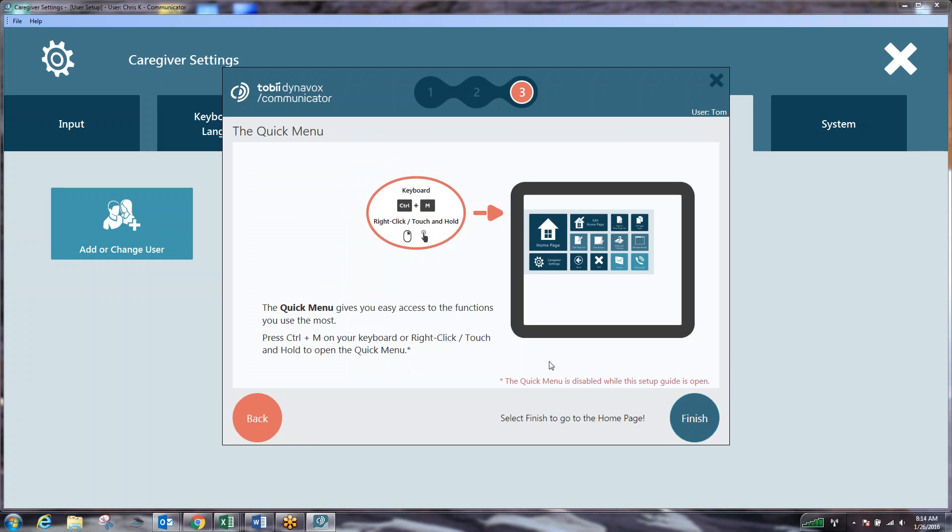What this describes now is the quick menu option. This is new to Communicator 5. If you hit the button on the left hand side of the device with three dots, you can quickly get to this quick menu guide at any time within the Communicator 5 software. Or if you touch and hold the screen it will pop up the menu. Or if you have a keyboard or a mouse plugged in you could hit control M or right click the mouse button to get to the menu as well. So we provide many ways to get to the quick menu option. Now we'll hit finish.